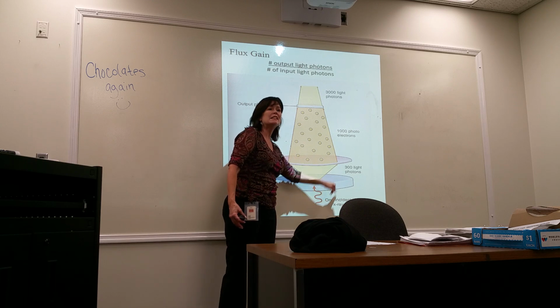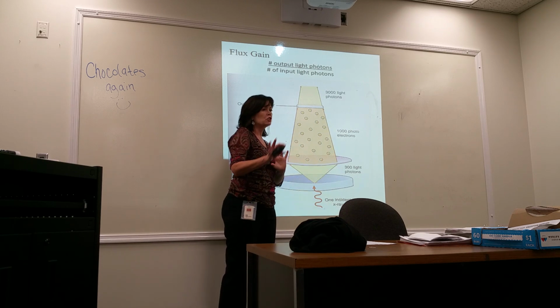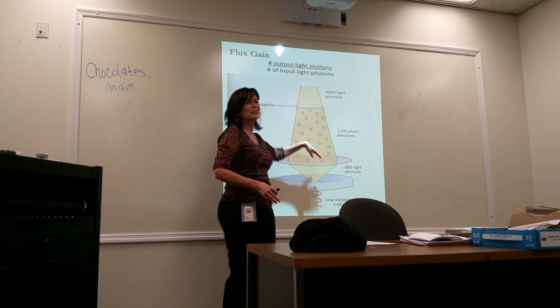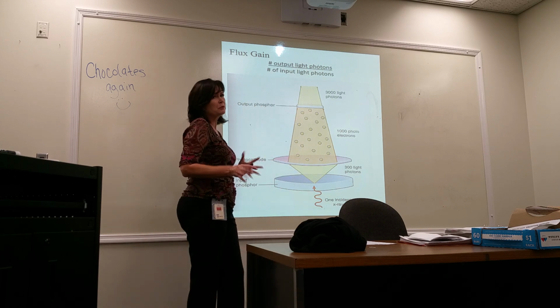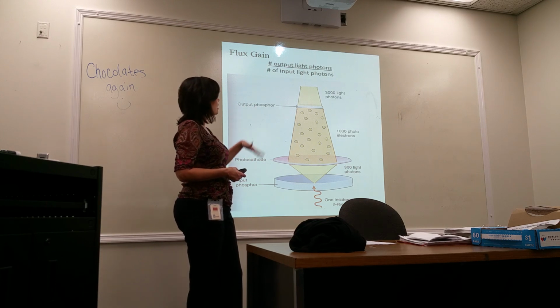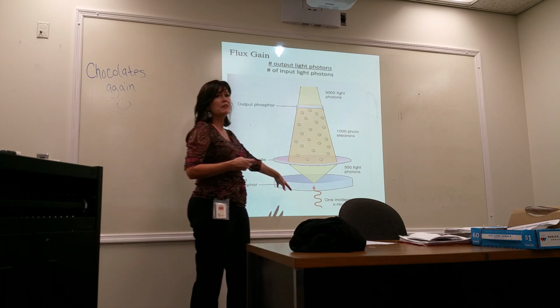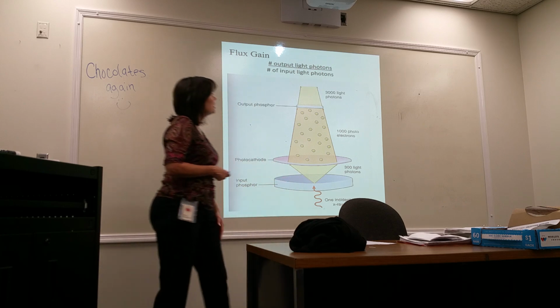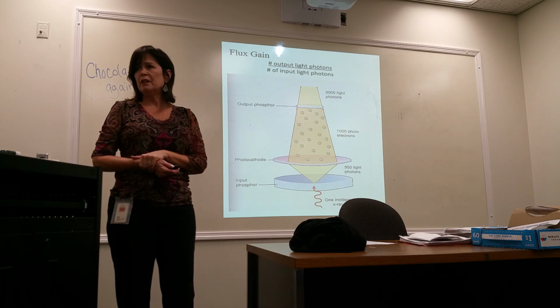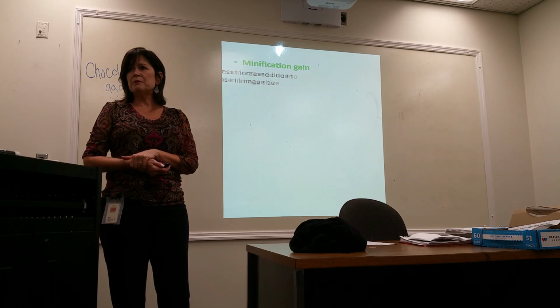We're not memorizing these numbers. That's just an example. Different books have different numbers, and it all depends on what phosphor is being used ultimately. So that is called the flux gain, the number of output light photons to the number of input light photons. So that is called the flux gain. The other is the minification gain.